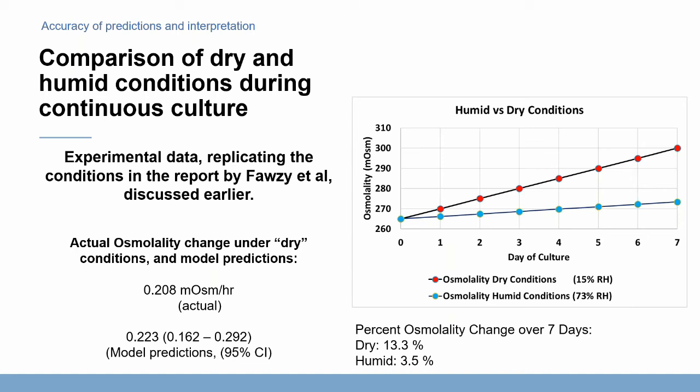And so finally, I'd like to end by discussing in a real world setting what people actually experience under these scenarios, and then show how the model would accurately predict this. If we go back to that paper I mentioned at the beginning of the talk, where this group set up an experiment and cultured embryos in a humidified and a non-humidified setting, I wanted to see what the actual numbers would be for osmolality change over time, which unfortunately they did not report in the original paper.